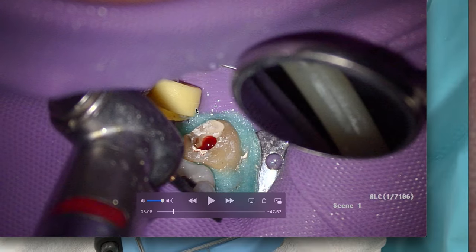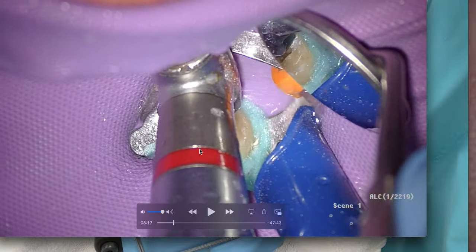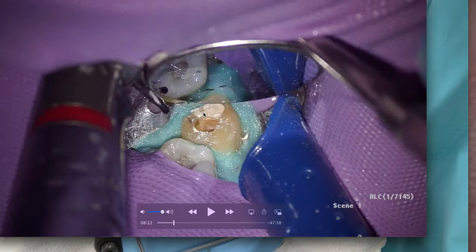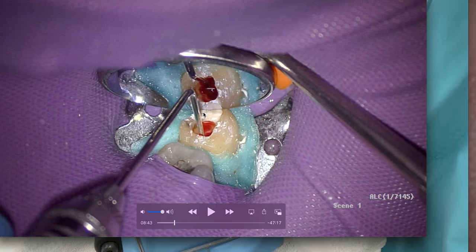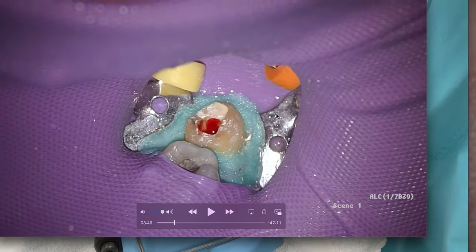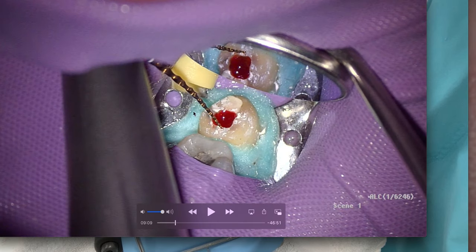Not much to see — I'm doing this by feel. You can see quickly we've got our access pretty much prepped. We've removed most of the pulp tissue. It's fairly hyperemic, which gives me one indication that the tooth is fairly inflamed — consistent with what we diagnosed as irreversible pulpitis.